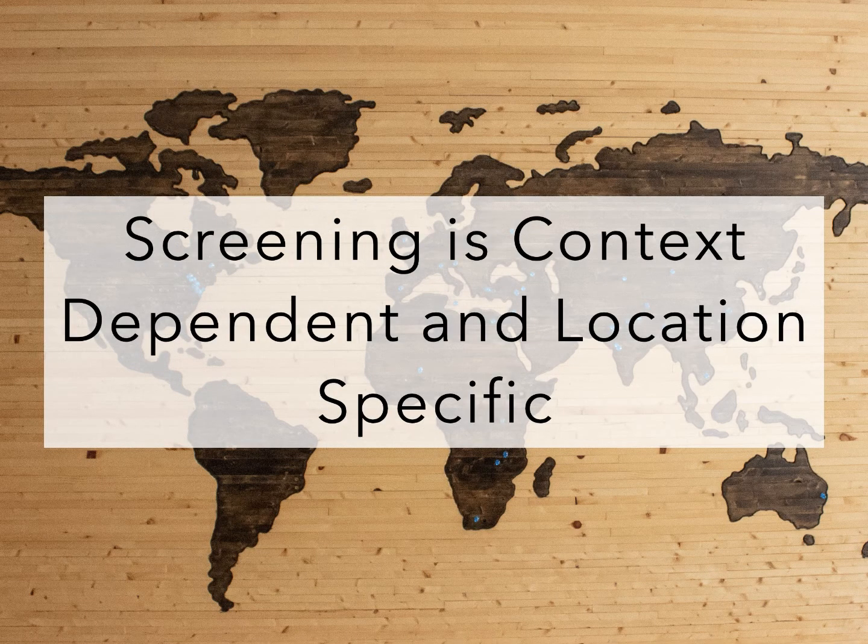However, let's keep in mind that screening is very much context dependent and location specific. For example, if you're screening an overwhelming number of patients in a tent with no other resources, maybe it makes sense to use lung ultrasound. But I've also heard of outdoor screening tents that only use clinical assessment based on work of breathing, vital signs, and pulse oximetry to determine patient disposition.